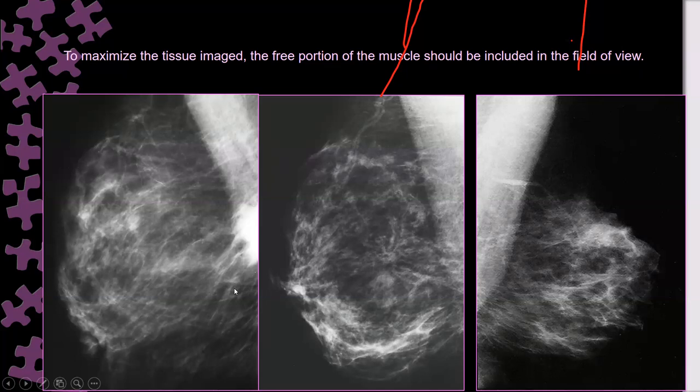Can you imagine? In the middle, the lower part of the pectoral was not visible. Yeah, look, this is easy, we pass it during practice. Optimum. It was not. When they pulled it more, the cancer lesion appeared. There was more cancer here. Can you imagine that? They pulled it more because the inferior edge was not visible, and there was no suspicious clinical finding.